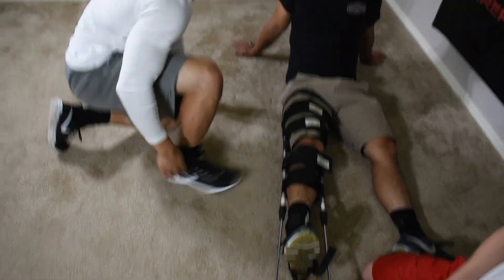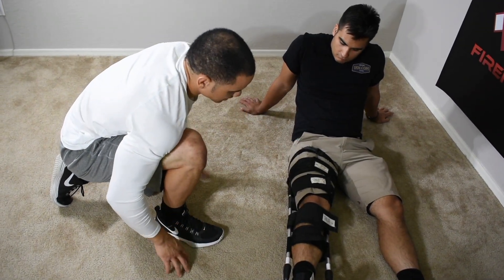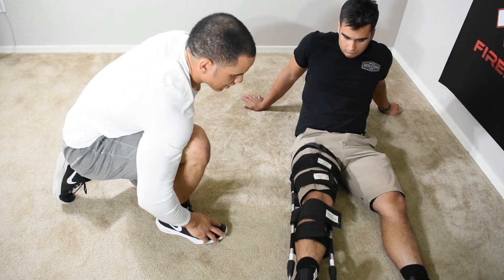My partner and I are going to get a backboard. We're going to secure the patient's torso to immobilize hip movement, then secure the splint to prevent it from moving, and then we're going to transport.